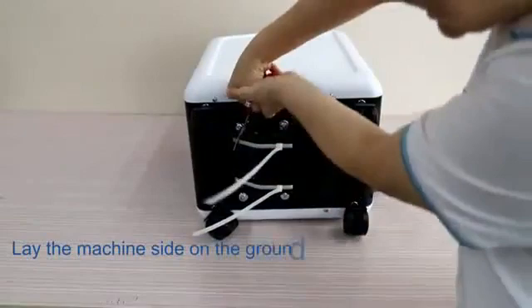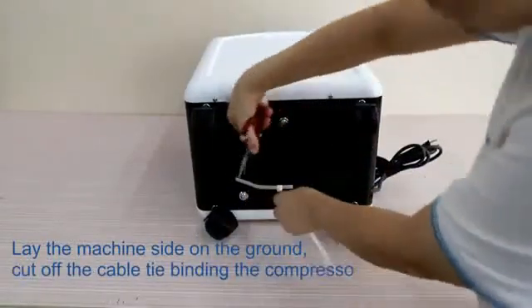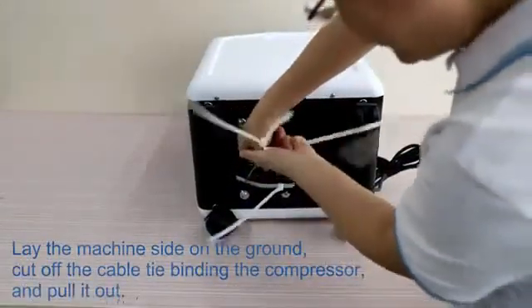Lay the machine on its side on the ground. Cut off the cable tie binding the compressor and pull it out.